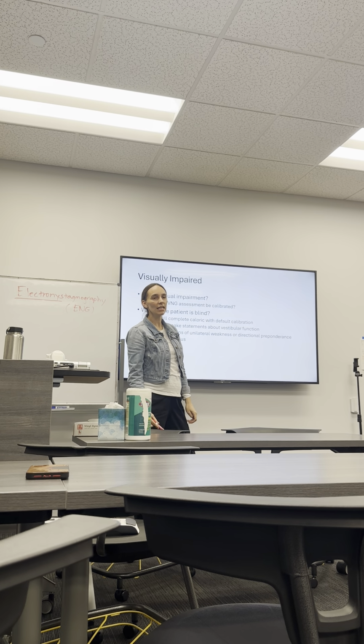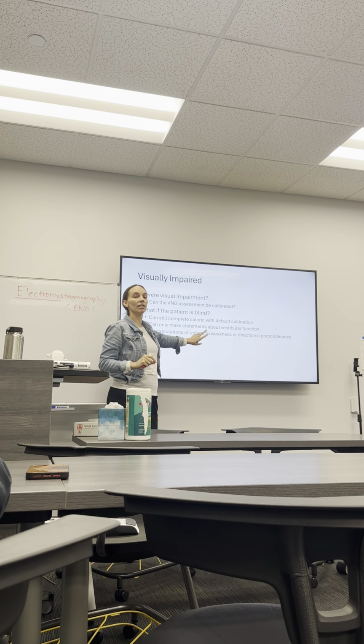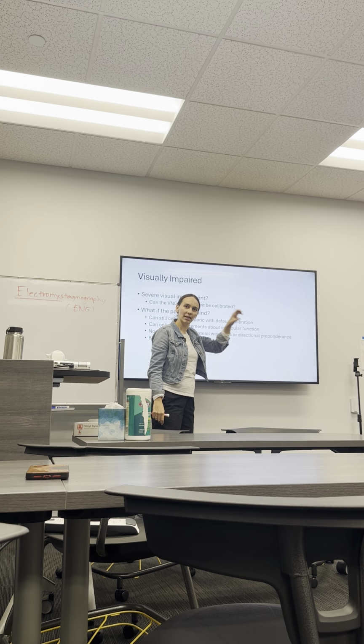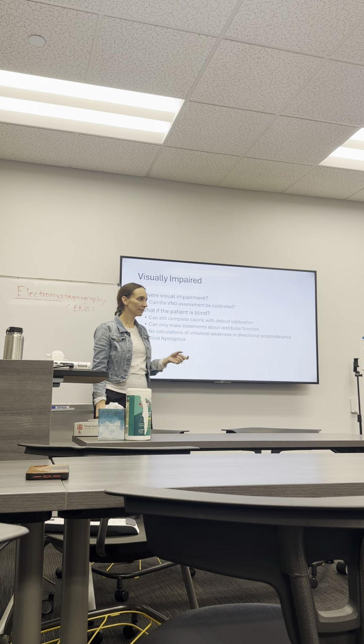Okay. So when we think about this, we are expecting in a healthy system to see this pattern. It is when we don't generate a response, or the response is weaker, that we start to worry about a unilateral weakness, one side not being as responsive as the other, as well as when we see nystagmus that's always stronger to the right. That directional preponderance tells us something about how the system is generating the nystagmus direction.